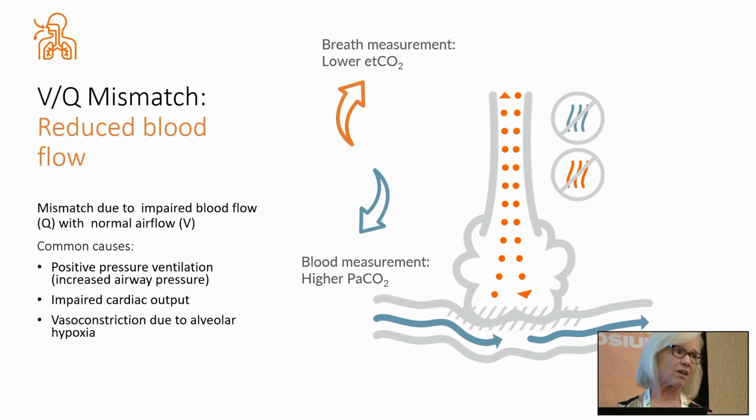Do you guys have any thoughts on ventilation perfusion mismatch, or anything you want me to clarify on it? I know that when it comes to this transcutaneous CO2 monitoring, that's really the big difference between us and end-tidal monitoring. If y'all have any questions at all, anytime, just interrupt me.